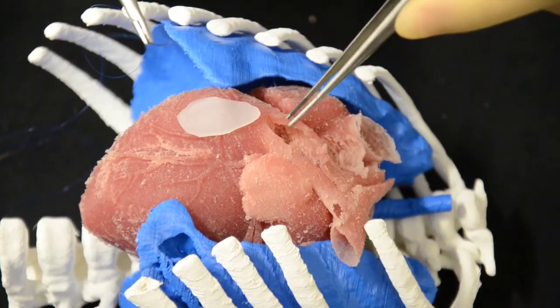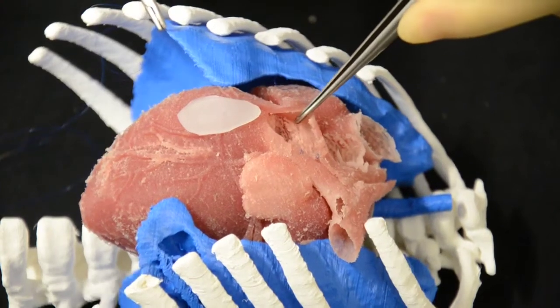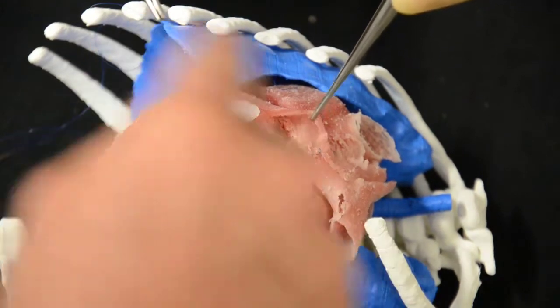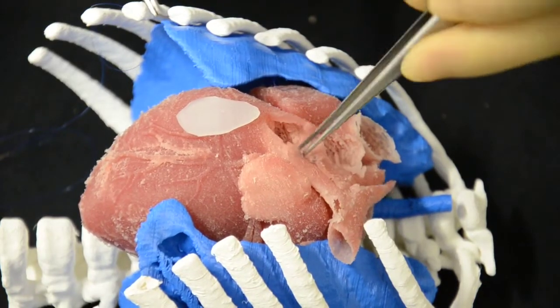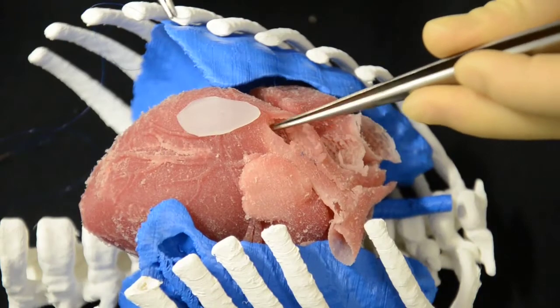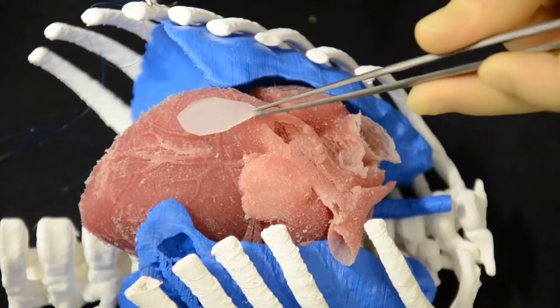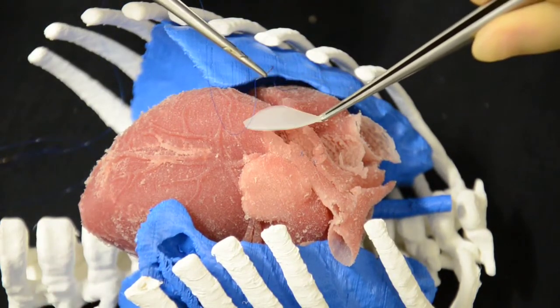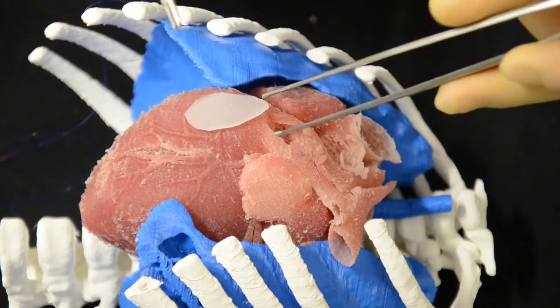Senior Registrar Giuseppe Pelella, who is our main trainee, is going to demonstrate how to do a transannular patch of the pulmonary artery, which he's touching at the moment in a patient with tetralogy of Fallot. This is a great training exercise for that. He's going to use some very small sutures and a special patch that has been designed for that. Giuseppe is an expert, so he will do a great job.